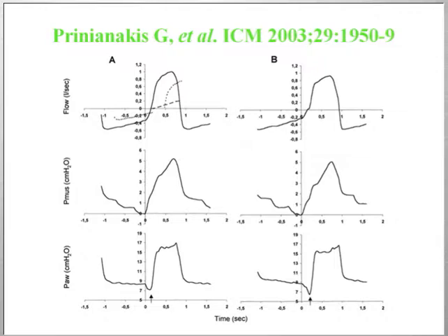Again, this is a more recent work analyzing new and sophisticated triggering and cycling-off mechanisms for a pressure support ventilator. This is a nice physiological and clinical study done by Prinianakis and his co-workers.